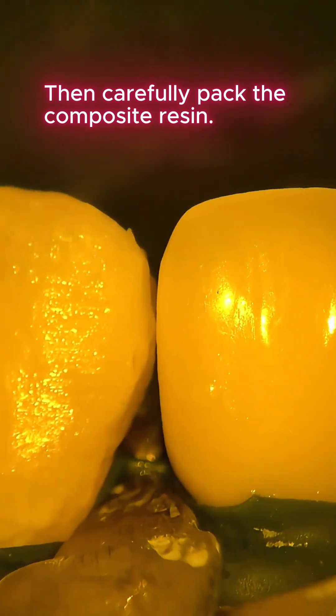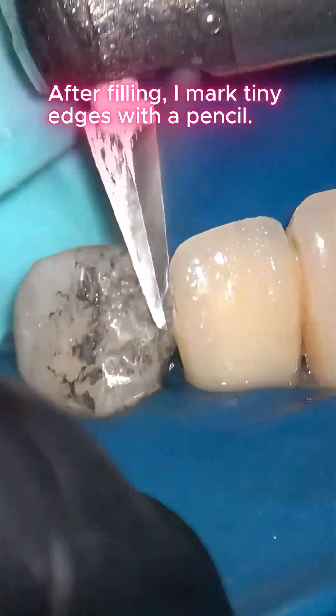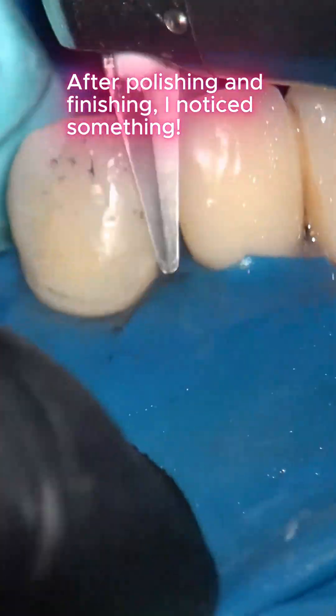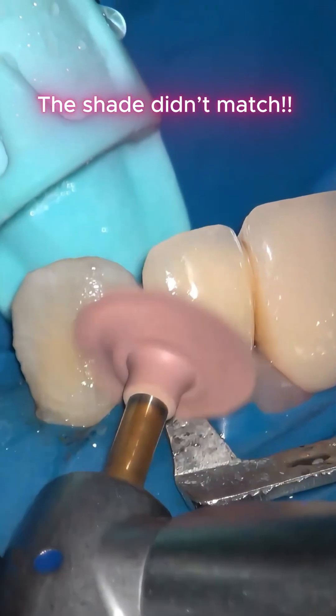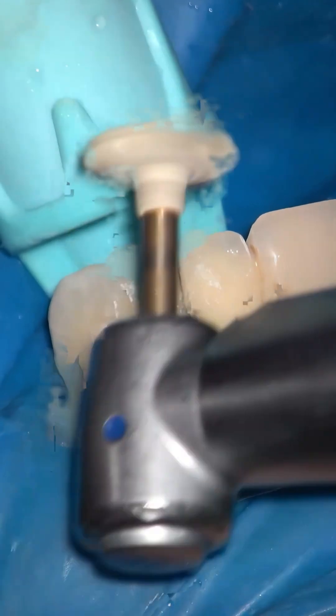I carefully pack the composite resin. After filling, I mark tiny edges with a pencil and carefully trim them. After polishing and finishing, I notice something — the shade didn't match. The composite I placed was too white.